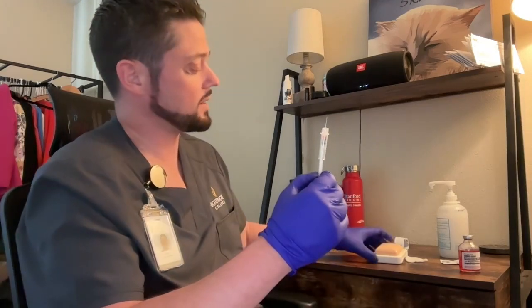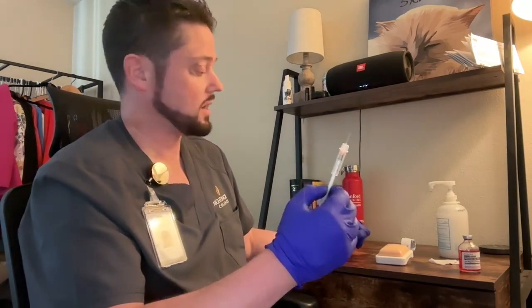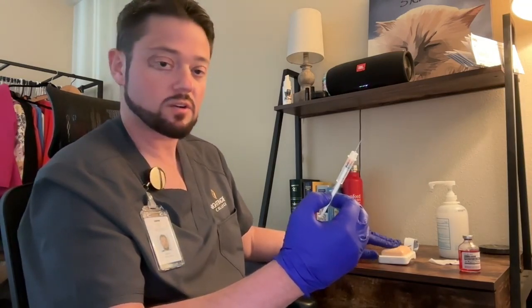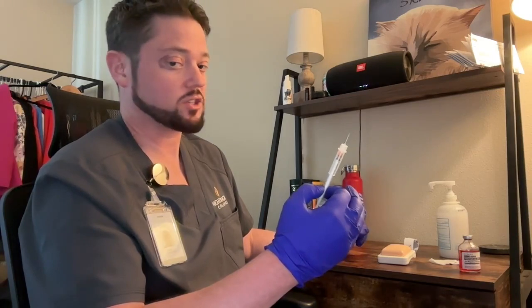So we're going to go ahead and assess our patient's forearm. We're going to try to use the anterior portion of the forearm if possible. So we're going to assess it. We want to palpate it for any tenderness. We're going to notate any abnormalities, any lesions, any bruising, any discoloration.